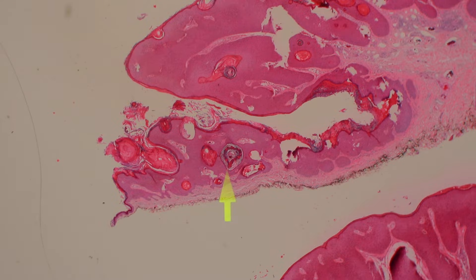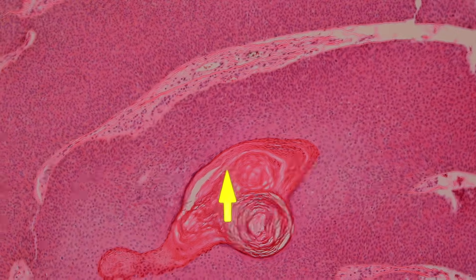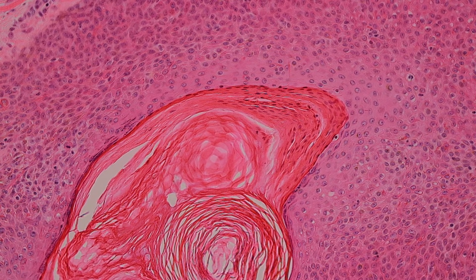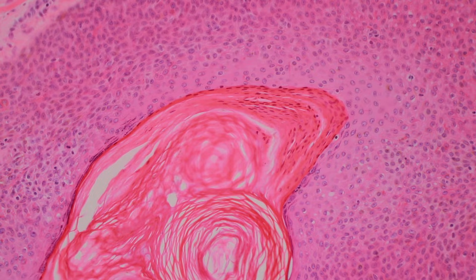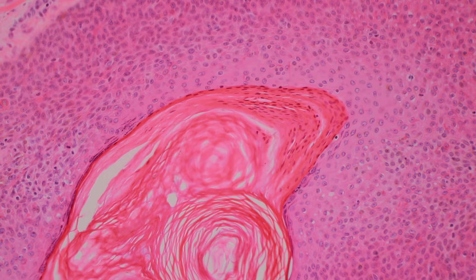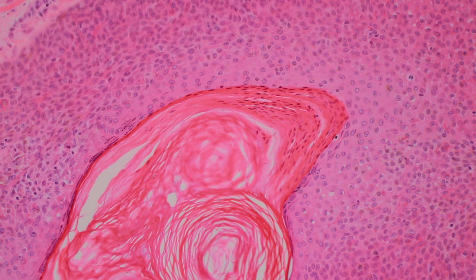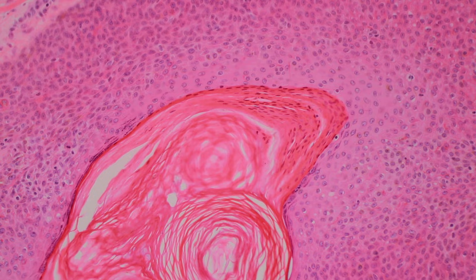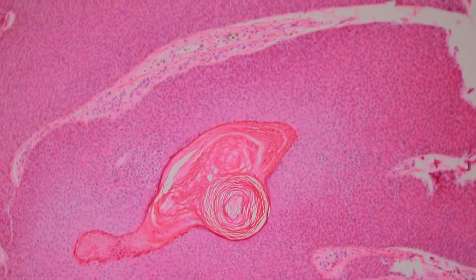Every once in a while there are exceptions to every rule. This is a horn pseudocyst, but it's got parakeratosis in it — it's got nuclei — and I told you that it doesn't usually do that, but sometimes it does. That's some parakeratosis, which you can see particularly in irritated or inflamed seborrheic keratoses. They can begin to get a lot of parakeratosis and can also have atypia and mitoses, which can actually be pretty tricky to tell apart from squamous cell carcinoma — something I still struggle with sometimes.